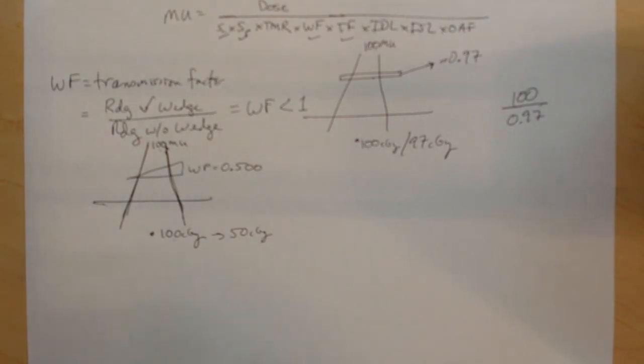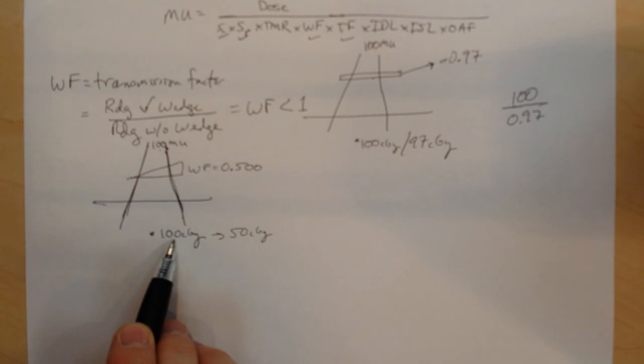Huge. As a dosimetrist doing your second hand calc, you should be within plus or minus 5% for normal geometries. The goal for some facilities is less than 2%. The goal of the hand calc is to catch gross errors. If you forget the wedge factor, this is not a gross error. This is a misadministration. The patient receives less than half the dose that they wanted to.